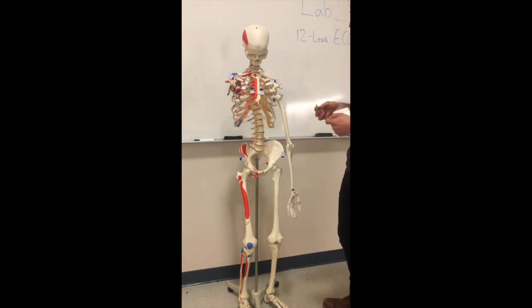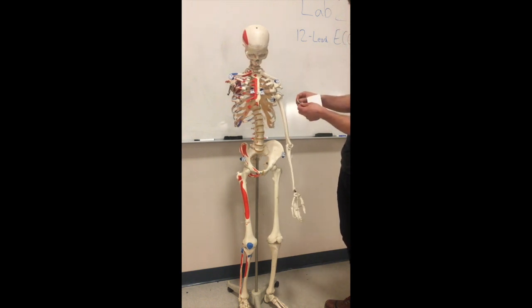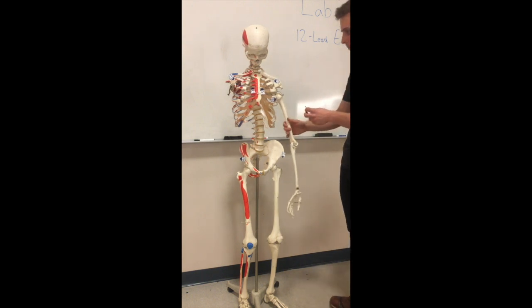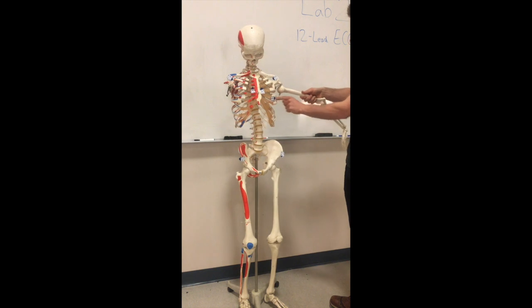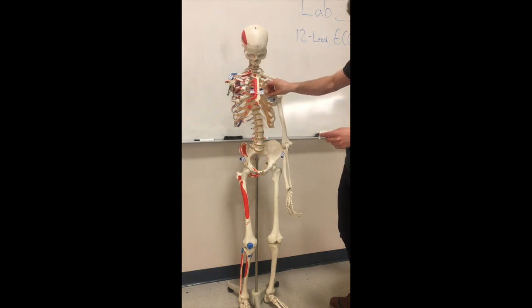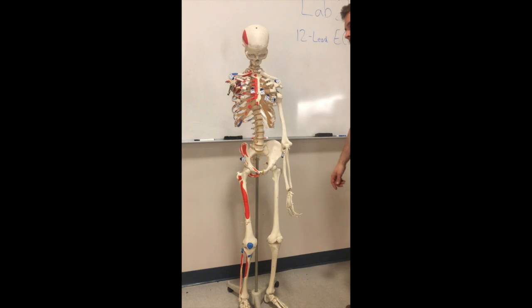Okay, V5 is again in the 5th intercostal space going to the side of the body. And the 6th electrode is again the same intercostal space, but just underneath the armpit. So now we have V1, V2, 4, 5, and 6, and now we'll place V3 directly in between V2 and V4.